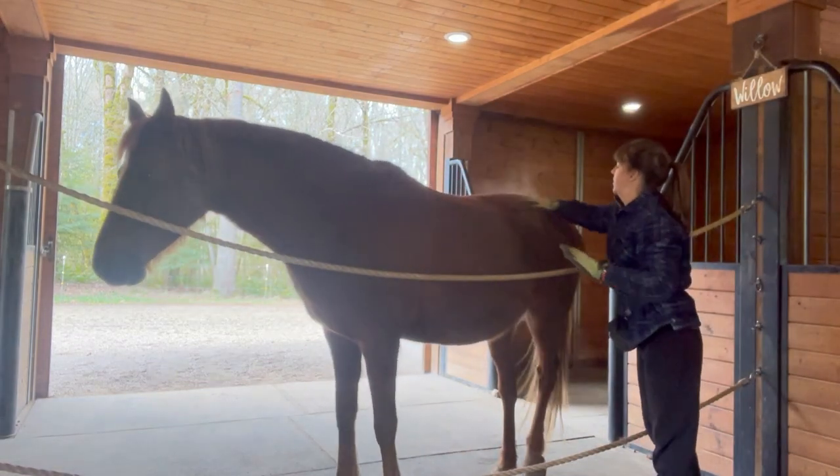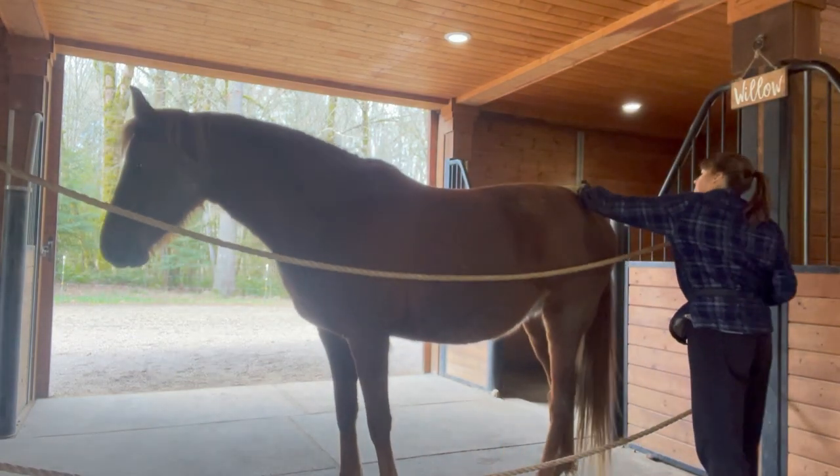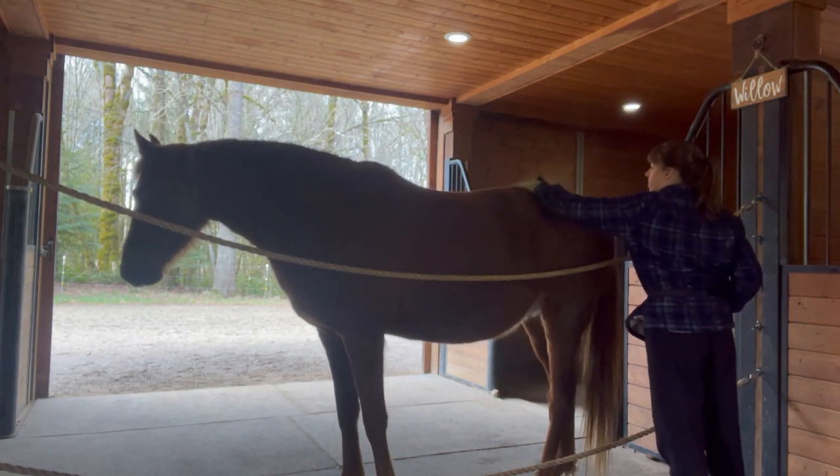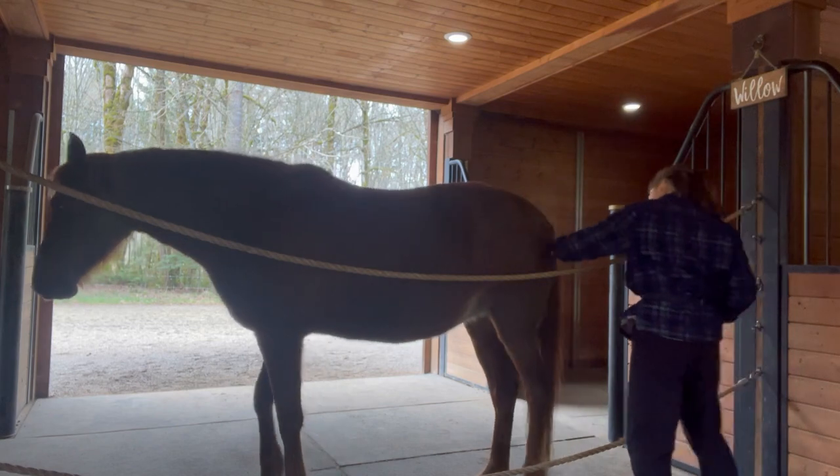Here, Aulia is really comfortable with having her tushy touched or sometimes her face. So we got behind a rope and slowly work where she is comfortable, building up from those areas she already accepts.